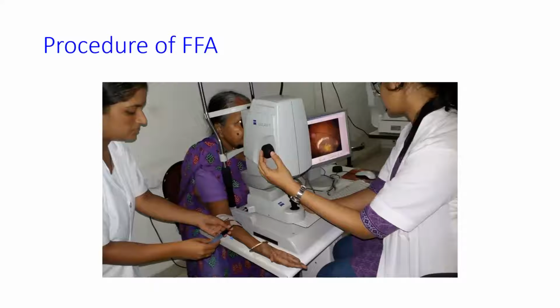This picture is of the procedure of fundus fluorescein angiography in progress. You can see the assistant holding a syringe filled with the dye, and the consultant is capturing the images using a fundus camera, as shown with the red arrow.